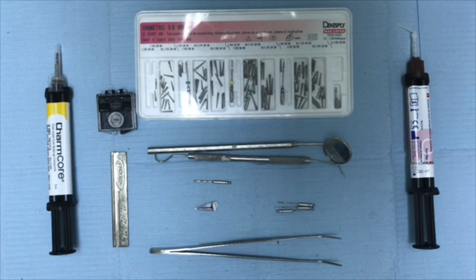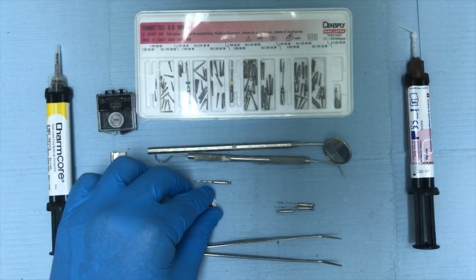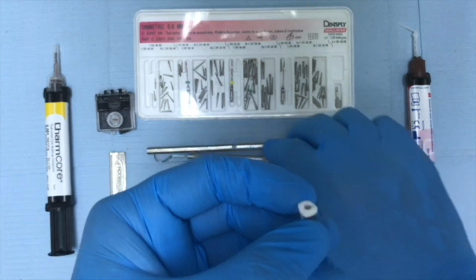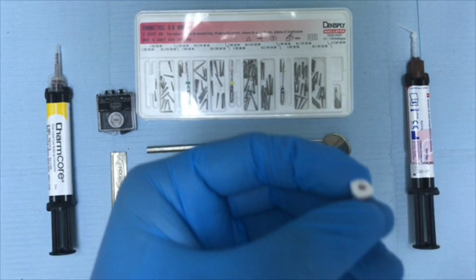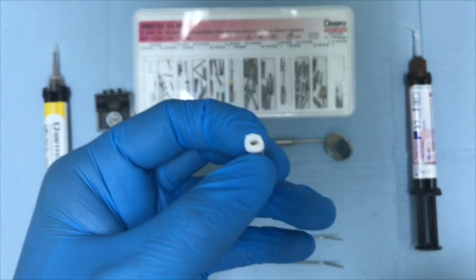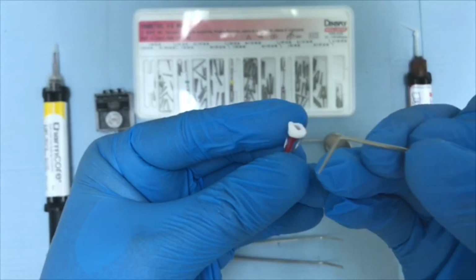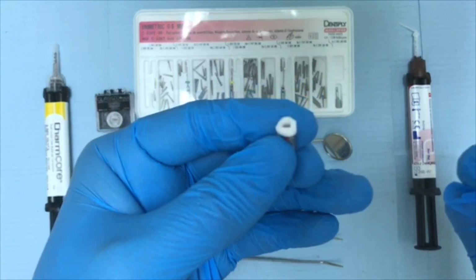In this video, I will demonstrate how to restore an endodontically treated tooth using a post and core system. First of all, I just want to highlight that post and core are indicated for badly decayed endodontically treated anterior and posterior teeth that lost most of their axial walls due to trauma or caries.